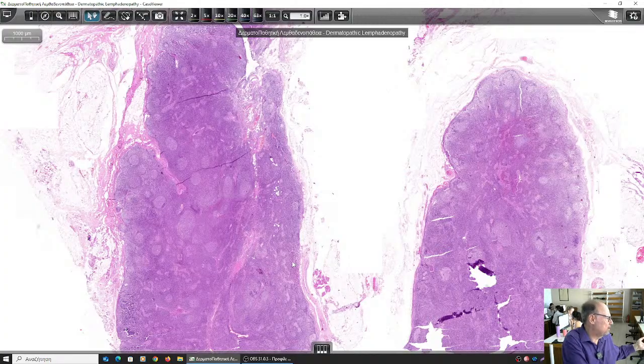This is not a sign of malignancy, because these are not malignant cells. There is a distortion in the architecture. However, it is not such a severe distortion that would justify the diagnosis of a lymphoma. And of course, if you have the immunomarkers, the B cells will be as they should be. Which are the immunomarkers of B cells? You should know the basic ones, CD19 and CD20. And which is the pan T cell marker? A marker for T cells, it's CD3 for all T cells.